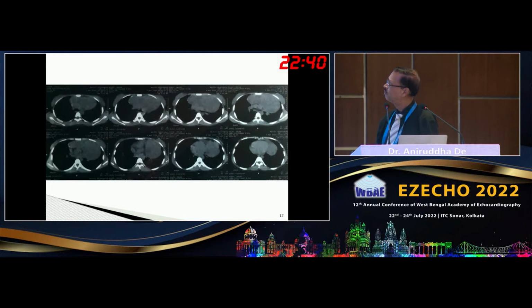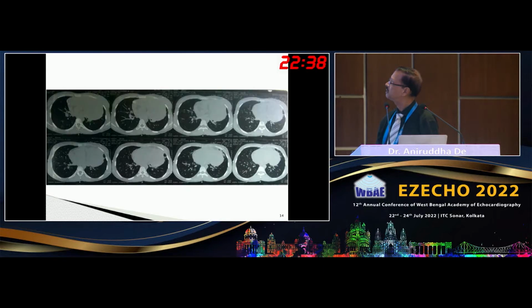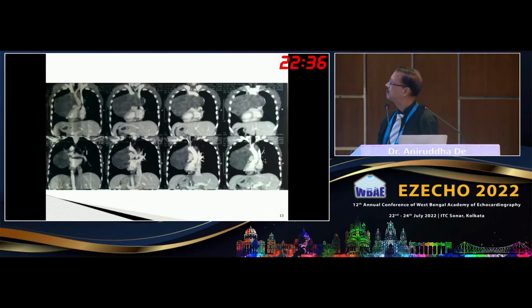So far, I learned from my radiologist friend what is there. The first thing we think of is there is a variegated appearance of the mass with specks of calcification around. But it is not a homogeneous mass. It is not a homogeneous anterior mediastinal mass. It is a non-homogeneous mass. So we think of the 3 Ts.